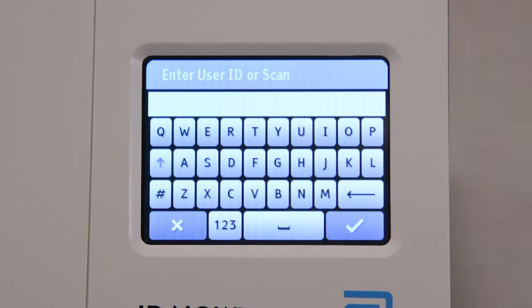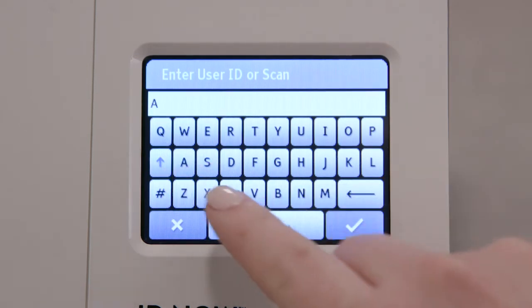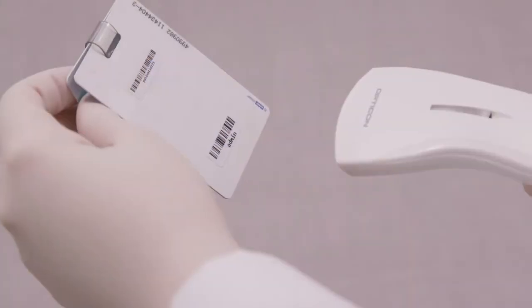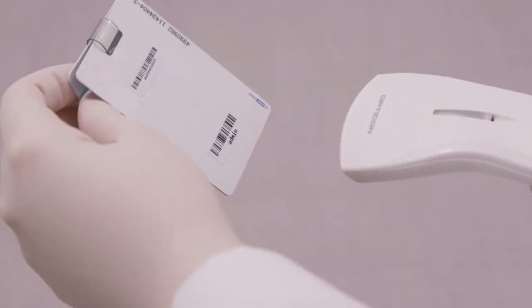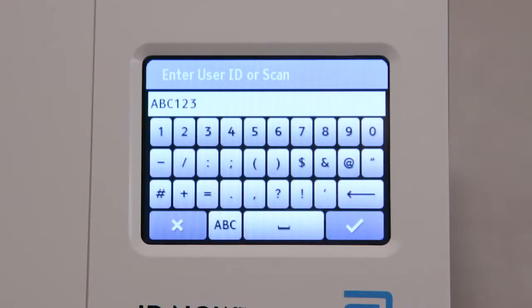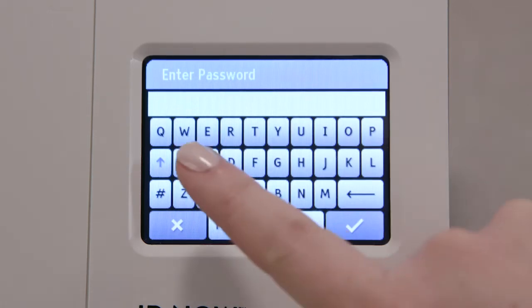When the instrument is switched on, or after another user has logged out, the enter user ID or scan screen will be displayed. Enter the user ID or scan it in using an electronic barcode reader. When entry is complete, press the check mark to advance.